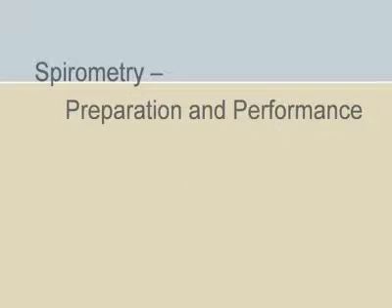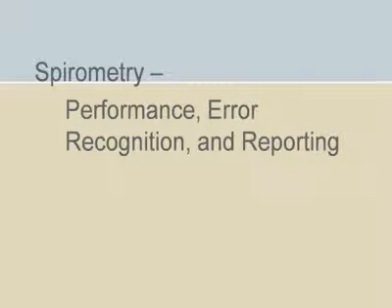This video provides comprehensive coverage of the first two steps, pre-test and testing. Checking results for acceptability and repeatability and generating reports is discussed briefly as well. However, these aspects of spirometry are discussed in greater detail and length in TechEd's Spirometry Performance, Error Recognition, and Reporting video. Each topic is introduced, defined, and reviewed in separate units.